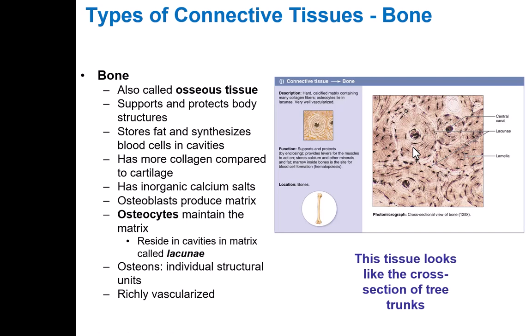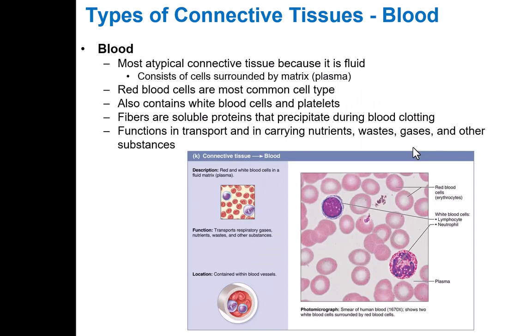And then blood, another type of connective tissue. Again, this is another one. You should look at it and just know what it is. So now this is something where you can use color to determine the tissue because blood tissue is always prepared the same way. So you're seeing these small pink cells with no nuclei. Those are red blood cells.